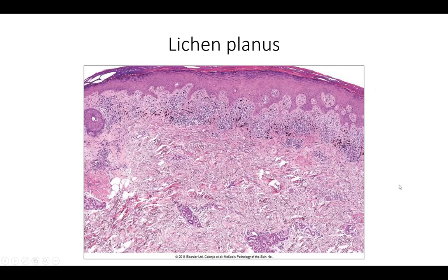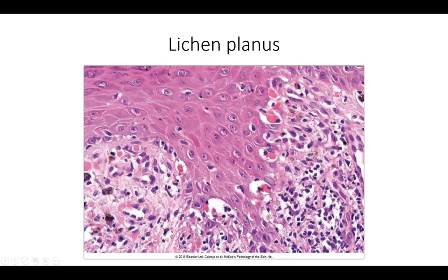Higher power shows degenerating keratinocytes and formation of colloid bodies — very eosinophilic proteinaceous material right along the basement membrane — with interaction with the dense lichenoid lymphocytic inflammation obscuring the basement membrane. It's normal to have some spongiosis overlying lichenoid inflammation, but with such a dense lichenoid pattern, you should be thinking lichenoid inflammatory pattern as opposed to spongiotic change.